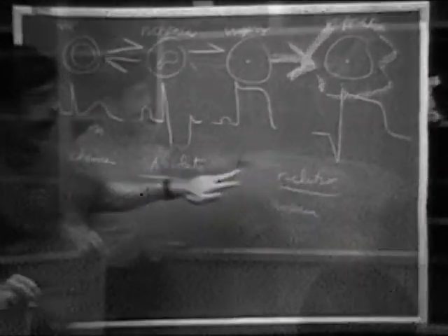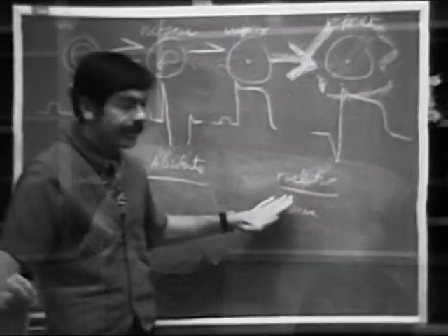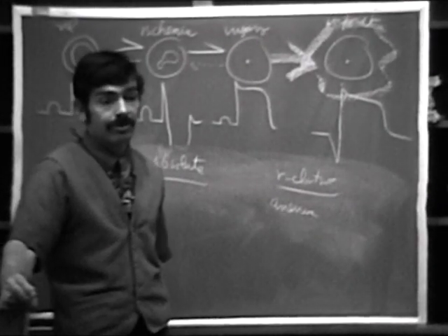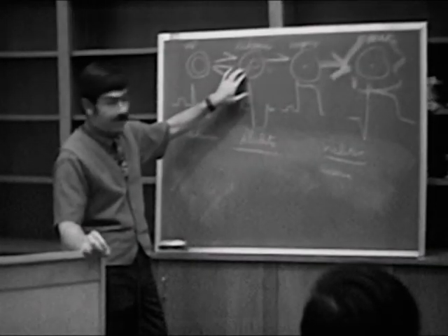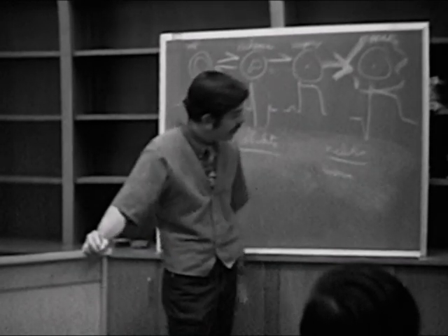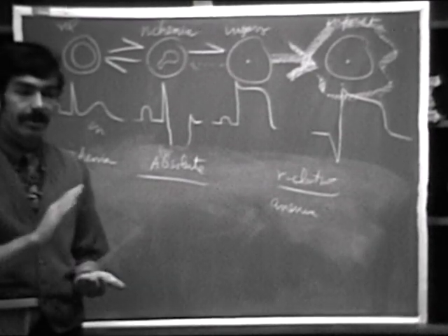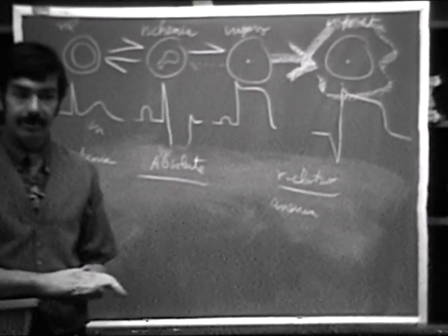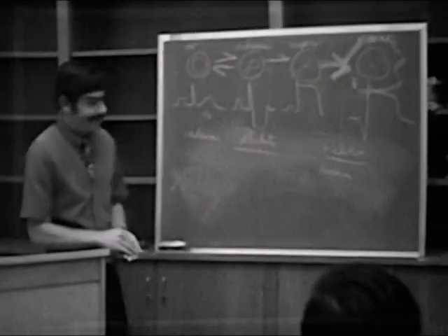As a matter of fact, it's likely that if the vessel is completely normal, you can put tremendous workloads on the heart and you won't see ischemia. But if someone has small amounts of vessel disease plus an excessive load on the heart, then you may bring out ischemia and get the impression that there is more coronary disease than there actually is. All right? Everyone understand what I'm trying to get across here?